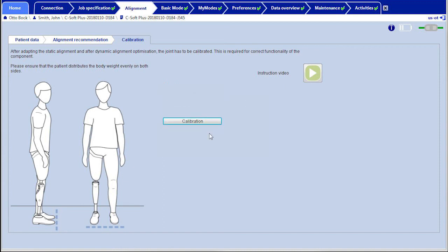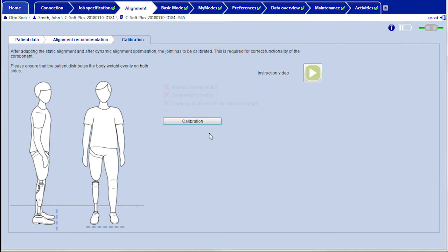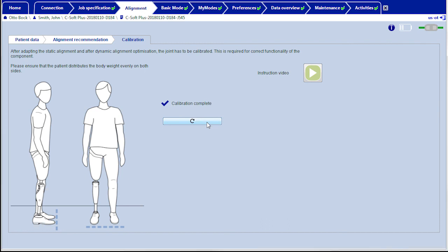The calibration can only be successfully completed once all of the deviations have been corrected. If calibration is not performed or is deliberately performed incorrectly, this may result in undesired behavior of the knee joint and restrict its function or even endanger the user's safety.